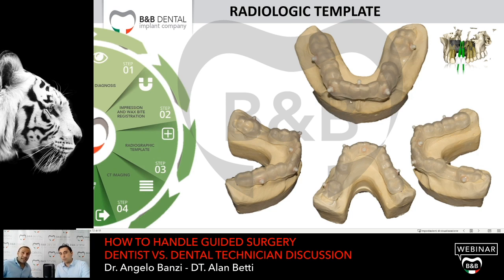we create, in this case, the radiological template. But this is a very old case. As Alan has mentioned before, in this case it's just one tooth, so the radiological template is not necessary. It's a very young patient, but he's got teeth.